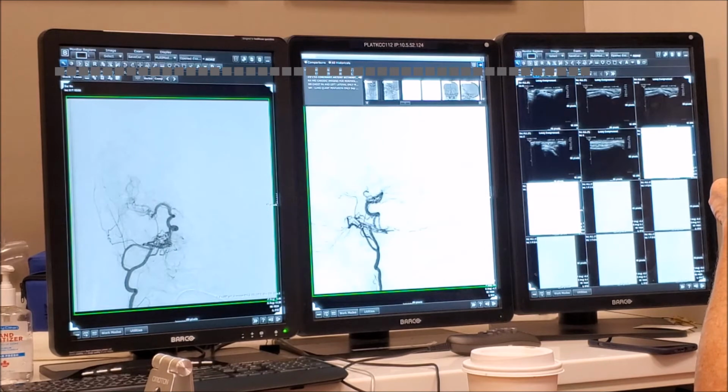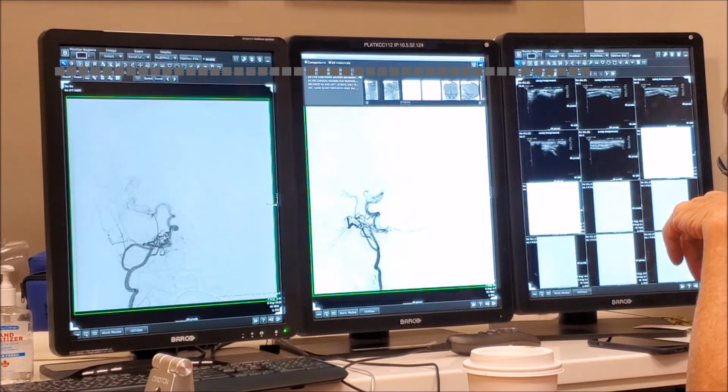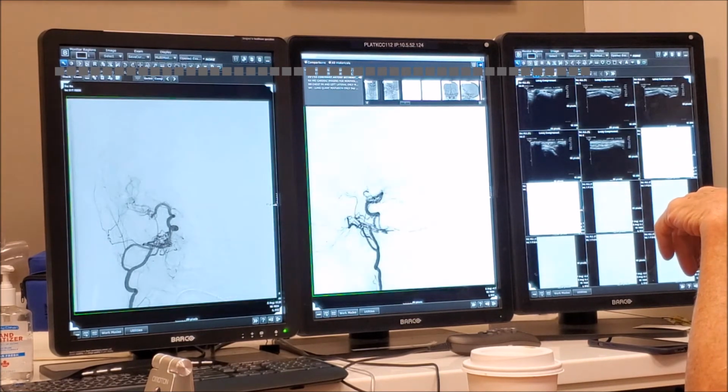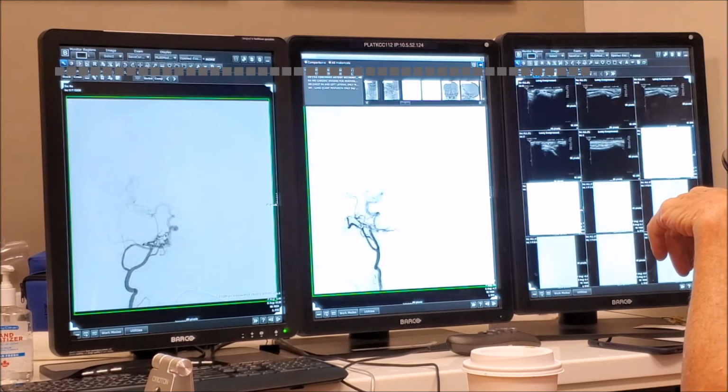Definitely, the way we're tracing, this is the internal carotid. We know that from the previous injection. And this internal carotid artery goes this way, downwards, right? Remember, it connected with that little string here. So if this is the carotid artery, then this probably is the accessory meningeal, which anastomoses with the rotundum.